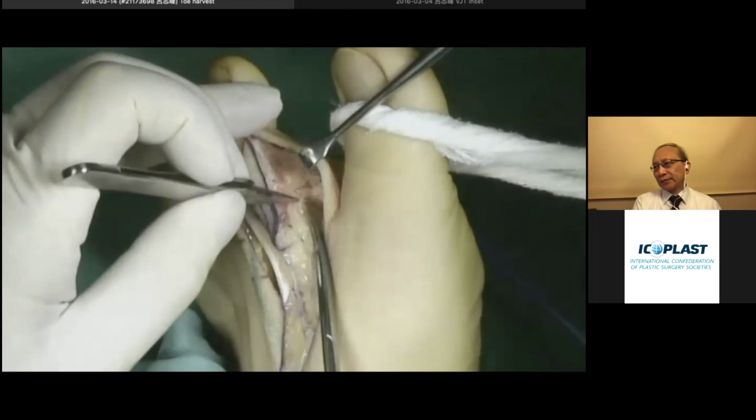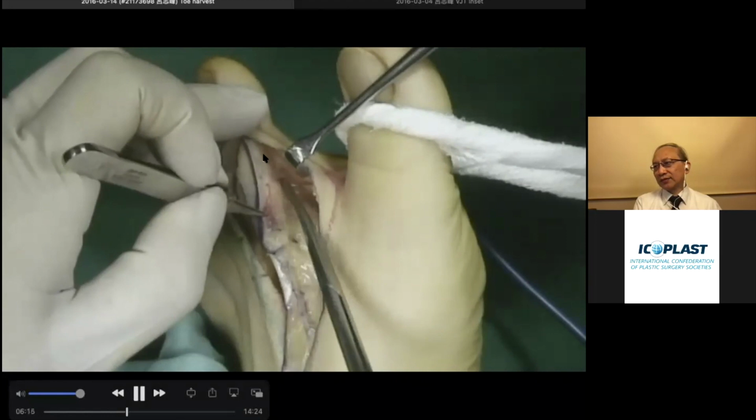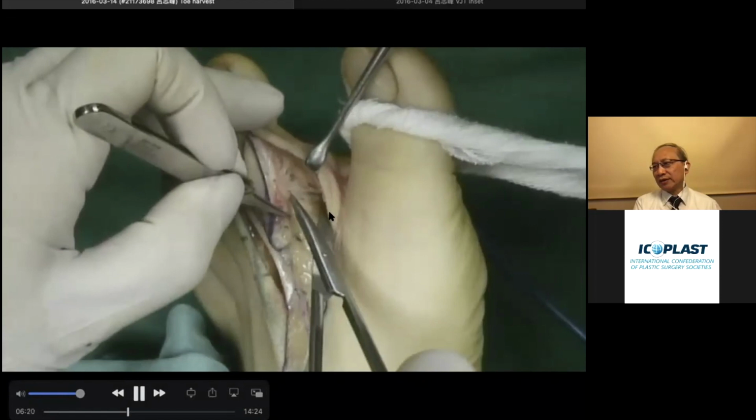Okay, continuing unroofing our vessels. So the digital arteries are here, and then here we'll go to the trifurcation area at this zone.